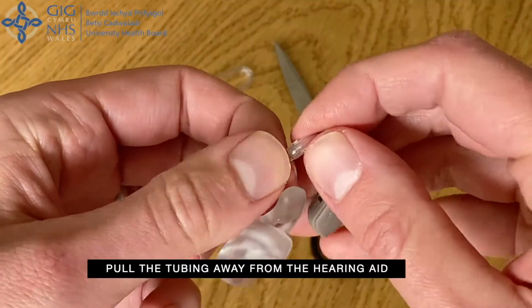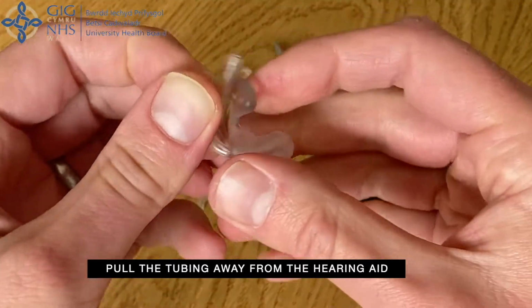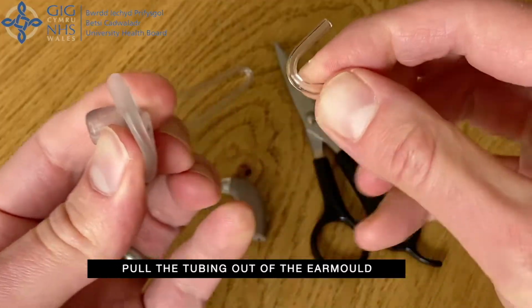Pull the tubing away from the hearing aid. Then pull the tubing out of the ear mould.